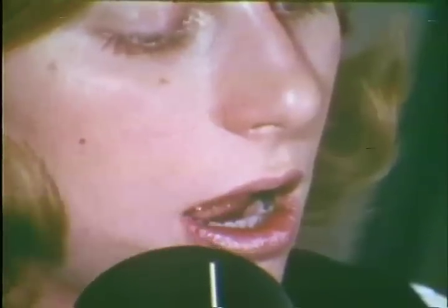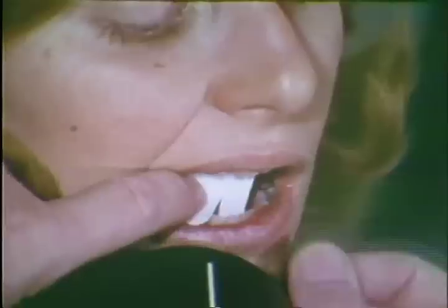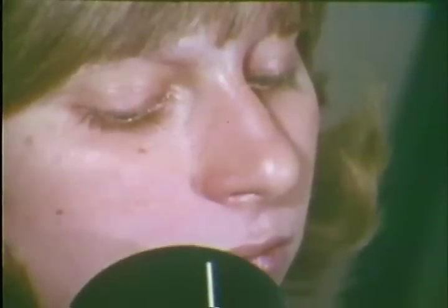It may be necessary to have another supplementary film for the lower cuspid-first bicuspid contact. In this case, the beam is aligned in the same direction that the eye looks through the interproximal contact area. The number 2 film packet is inserted and positioned perpendicular to the direction of the beam, and the patient closes slowly and carefully. The cone is carefully positioned, the alignment checked, lips closed, and the exposure taken. The X-ray cone is then taken away and the film removed in the usual manner.